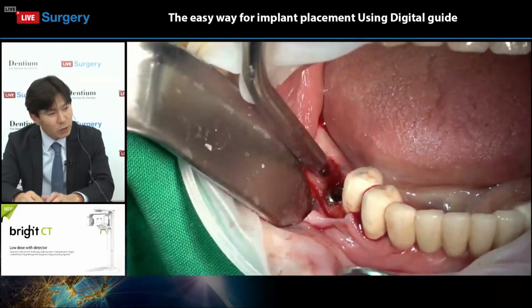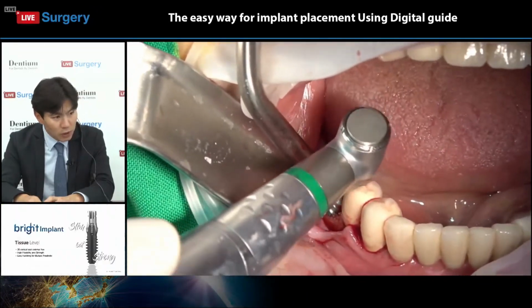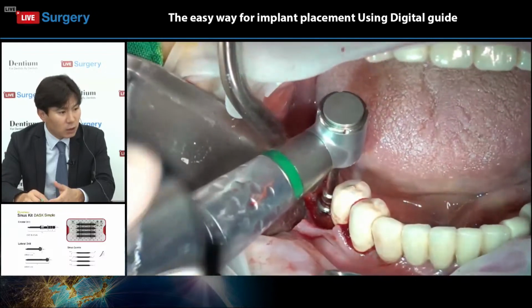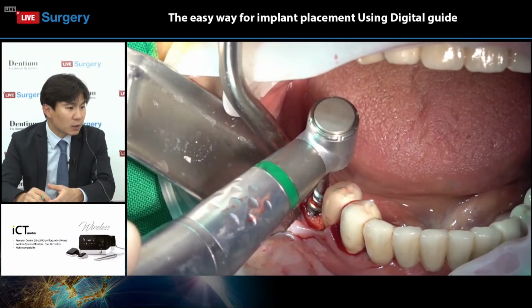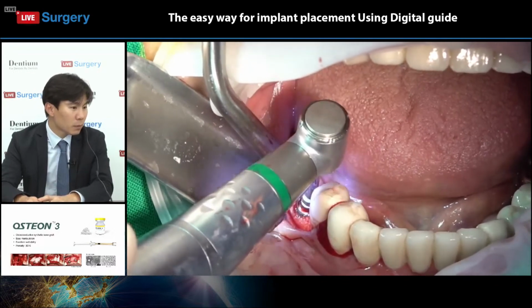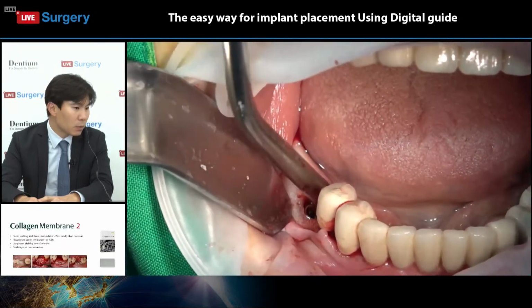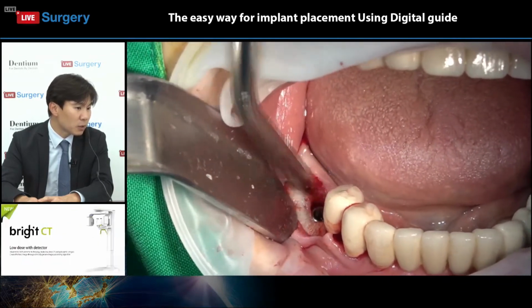I think this, because of the defect, the implant position should be calibrated manually. That's why he pulled out and pushing in the implant without surgical guide. Implants were placed subcrestally with respect to the proximal surface.